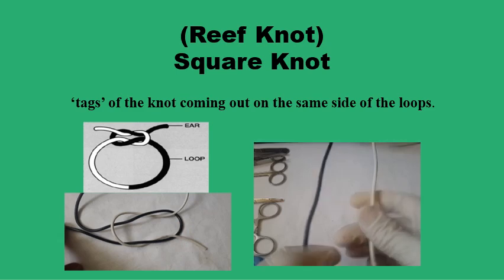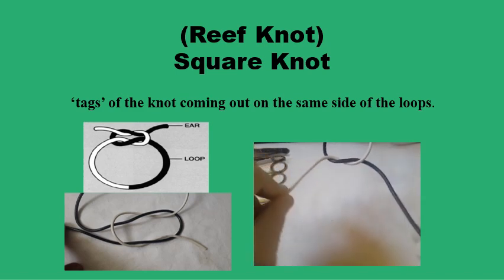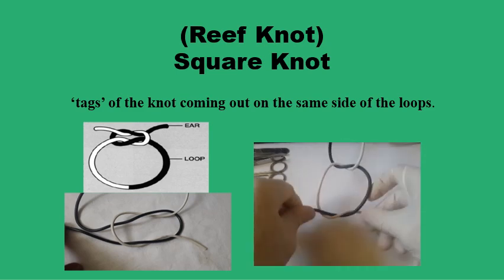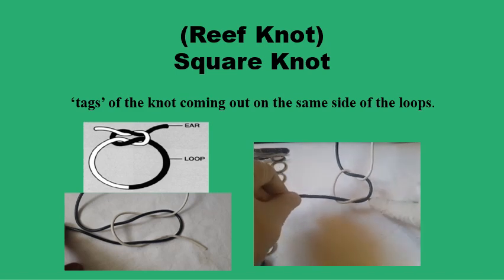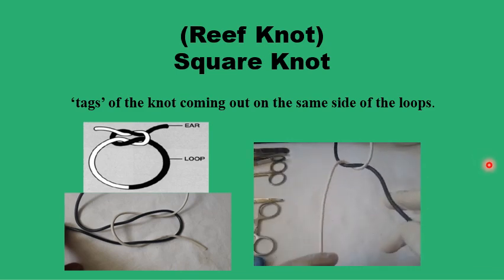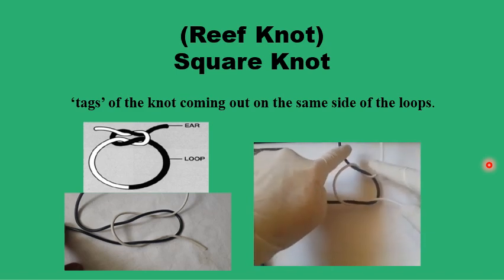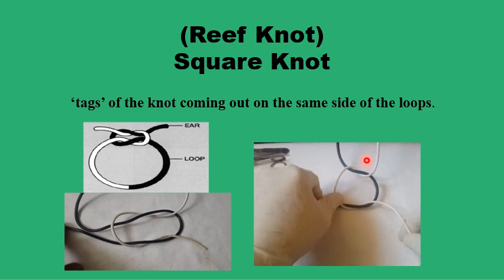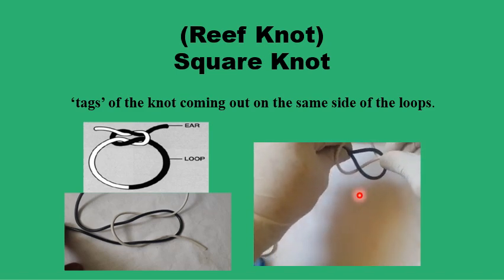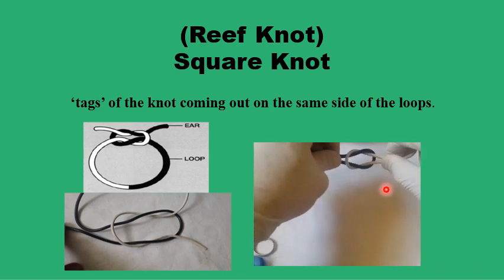This is how we do the reef knot. We're going to twist the white strand on the black strand in one direction — that's a half-reef knot. Now if we continue to do the second half-reef knot in the same direction, we'd end up with a granny knot, so we discard this. Instead, we cross hands and reverse the direction of the looping for the second half-reef knot. This way, we have the two white strands coming up above the black loop, and the two black strands below the white loop. Applying tension on the two ends of the strands, the two loops interlock and secure the knot.